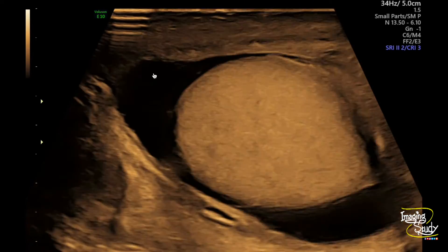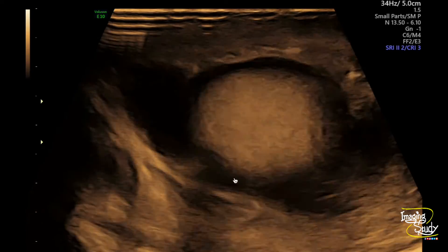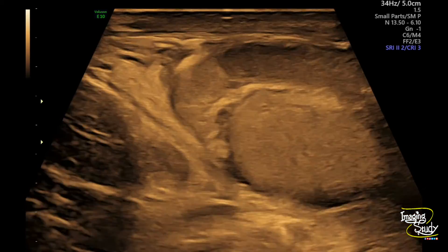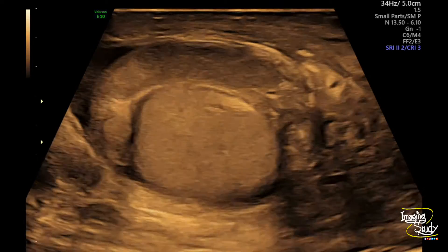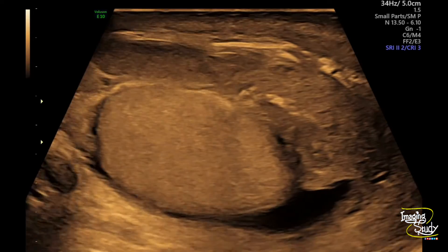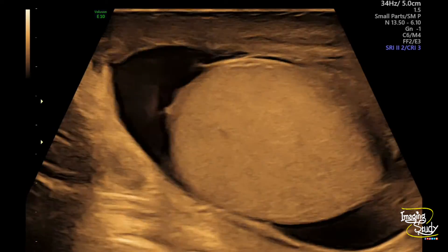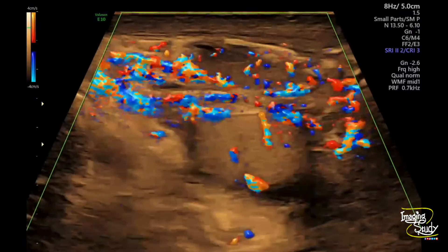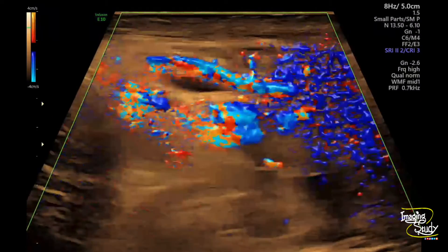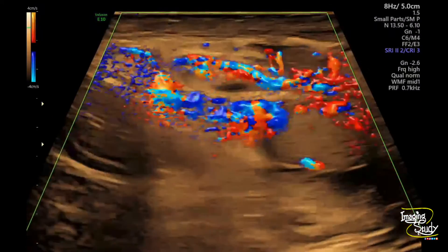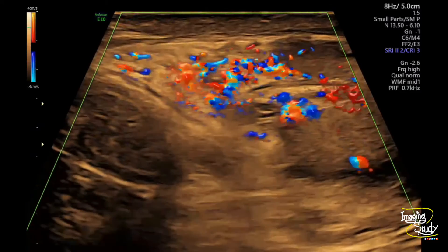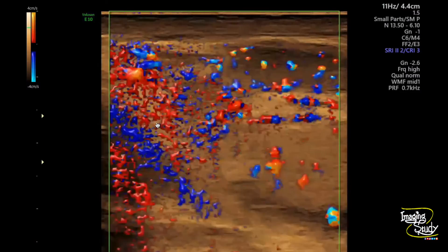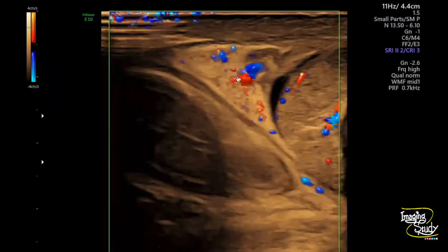Make sure to check for debris and septations within the hydrocele — they are very common due to the inflammatory process. Here is the color Doppler image, and you can see there is increased vascularity in the epididymis and upper part of the cord.